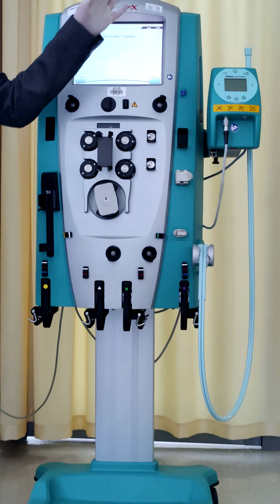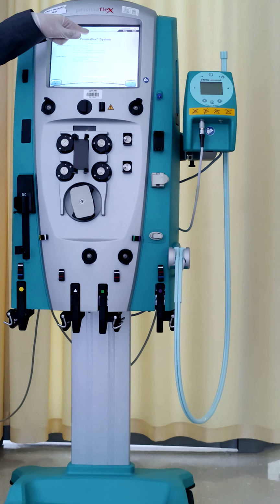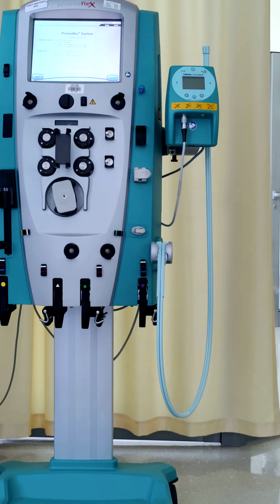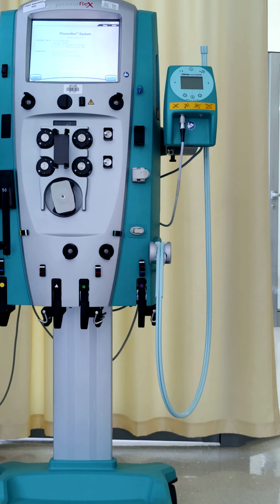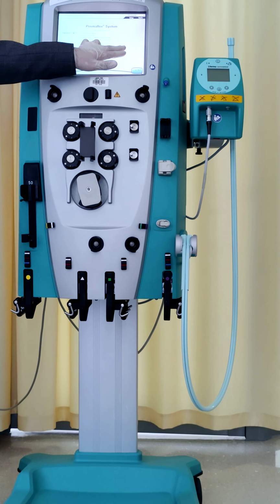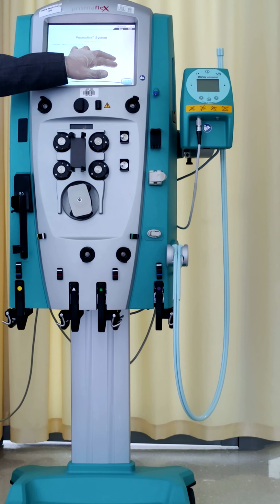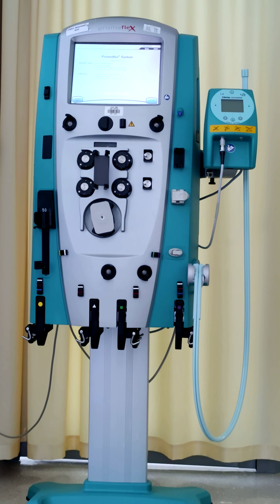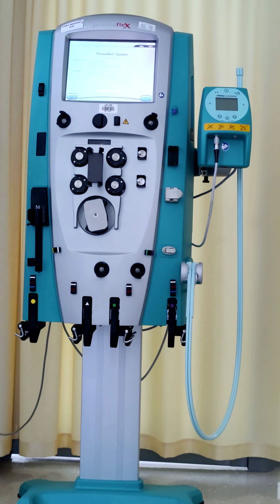Usually we have to observe the pressures during the treatment. Record the first pressures, like return pressure, access pressure, filter pressure, and compare them after half an hour. And check if they are increasing. You will find on the right side here TMP and pressure drop. Take the baseline or the first record and observe it during the session, whether it is increasing or decreasing. If it's in the same range, it's okay. It means you are on the safe side. If you find something drops or jumps, you have to take some action. Okay?